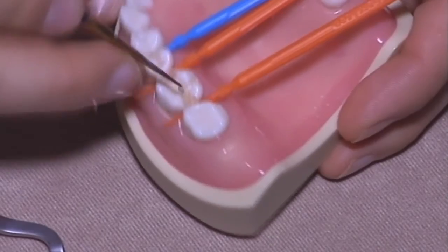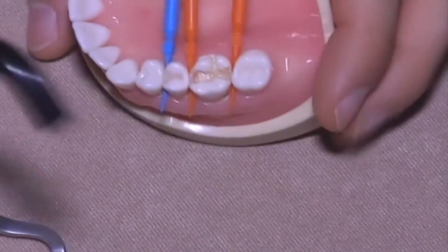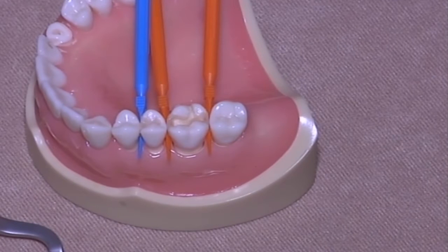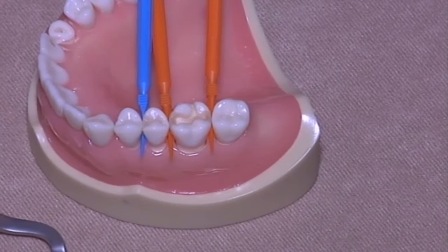Okay. And then light curing just to fix it. I think this patient is not gonna bite anything this evening.